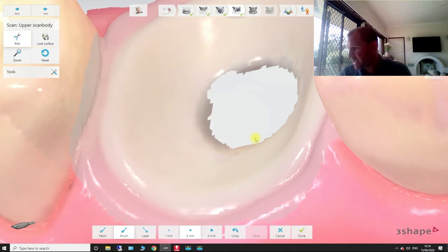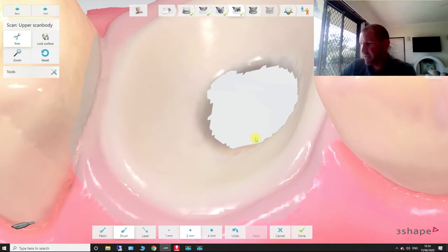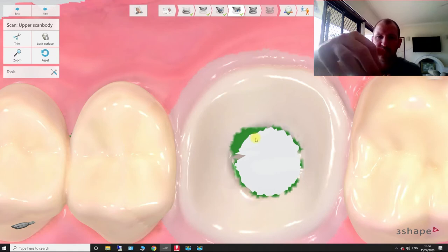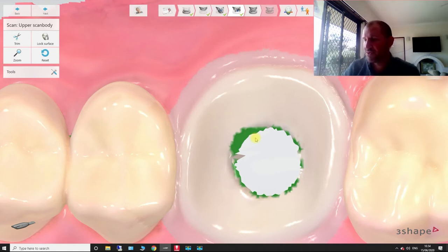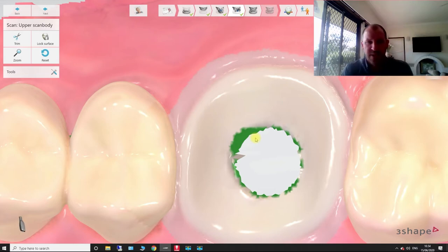Now, we're going to plug in or screw in our scan body. So each scan body system is different. But on this one, I'll just place it in, and then I'll screw it in. After that's screwed in, you do your x-ray to make sure it's seated.